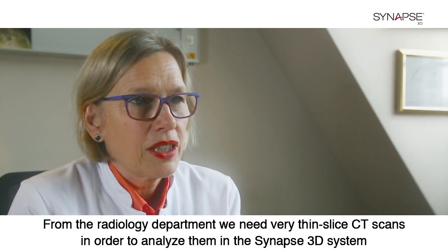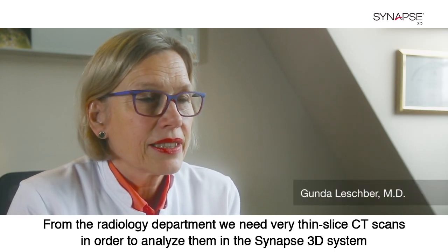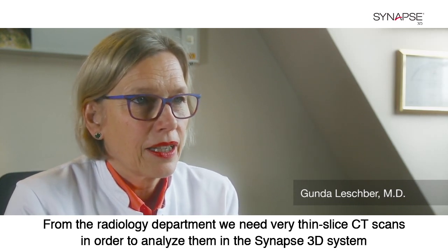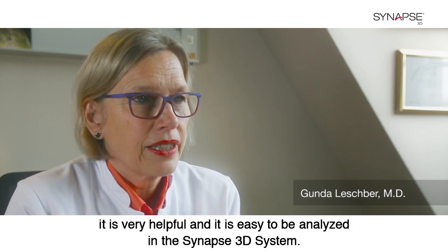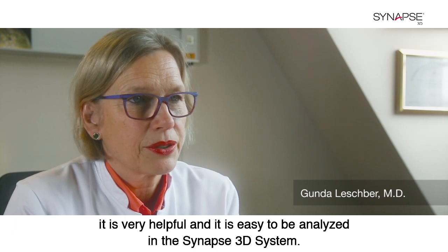Well, from the radiology department, we need very thin sliced CT scans in order to analyze them in the Synapse 3D system. And if the radiology department provides these thin slices, it is very helpful and it is easy to be analyzed in the Synapse 3D system.